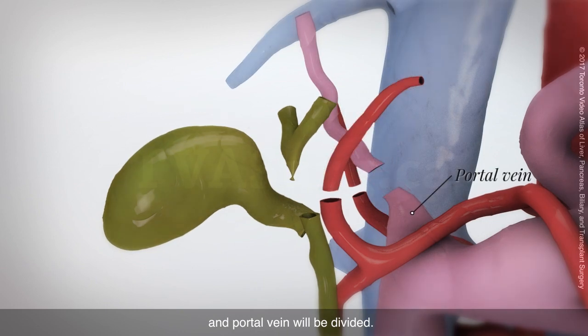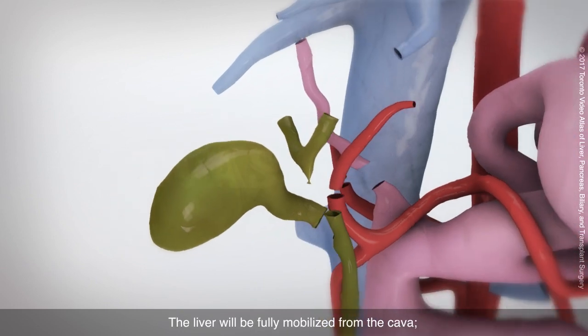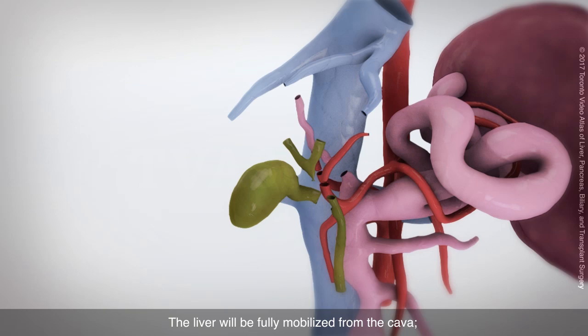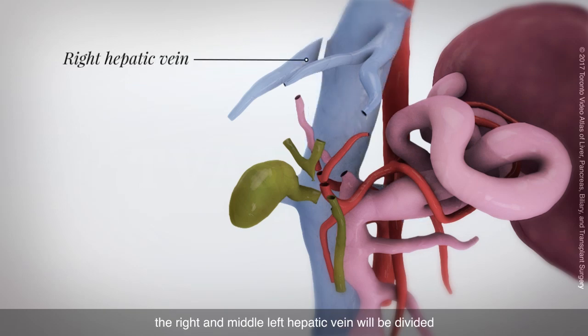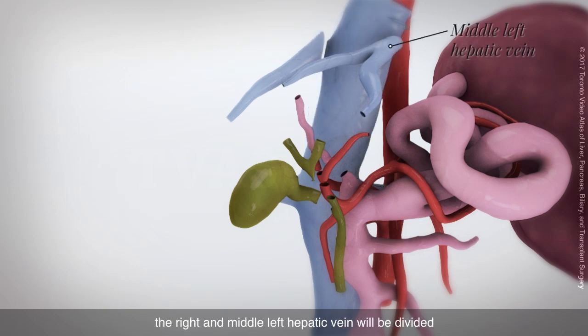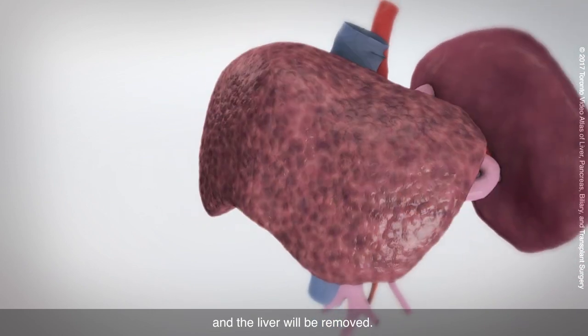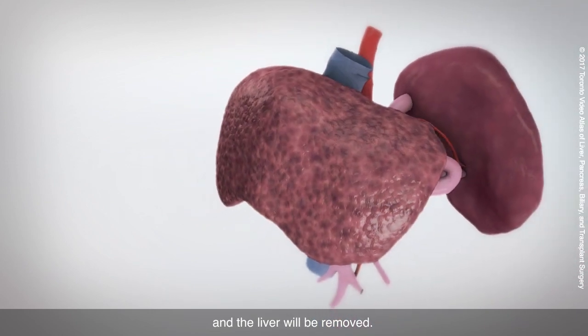The liver will be fully mobilized from the cava. The right and middle left hepatic veins will be divided, and the liver will be removed.